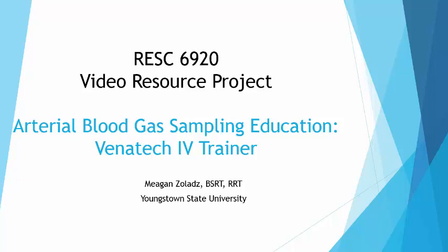Welcome. This is a presentation about arterial blood gas sampling education and using the Venatech IV Trainer. The purpose of this presentation is to show you how I use the Venatech IV Trainer to educate my students on how to draw arterial blood gases in the laboratory setting.